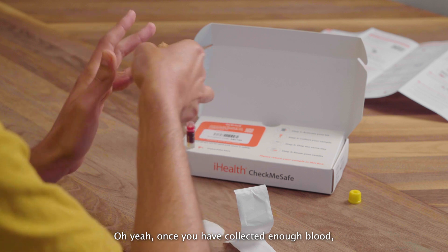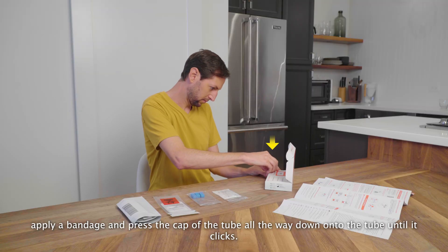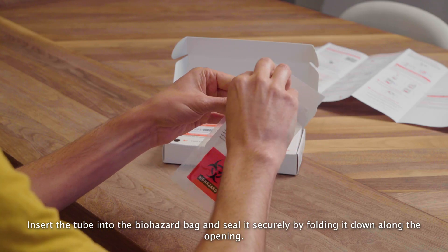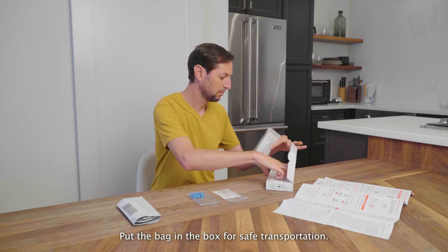Oh yeah! Once you have collected enough blood, apply a bandage and press the cap of the tube all the way down onto the tube until it clicks. Take out the tube and gently turn it upside down 10 times to fully mix the sample. Insert the tube into the biohazard bag and seal it securely by folding it down along the opening. Put the bag in the box for safe transportation.